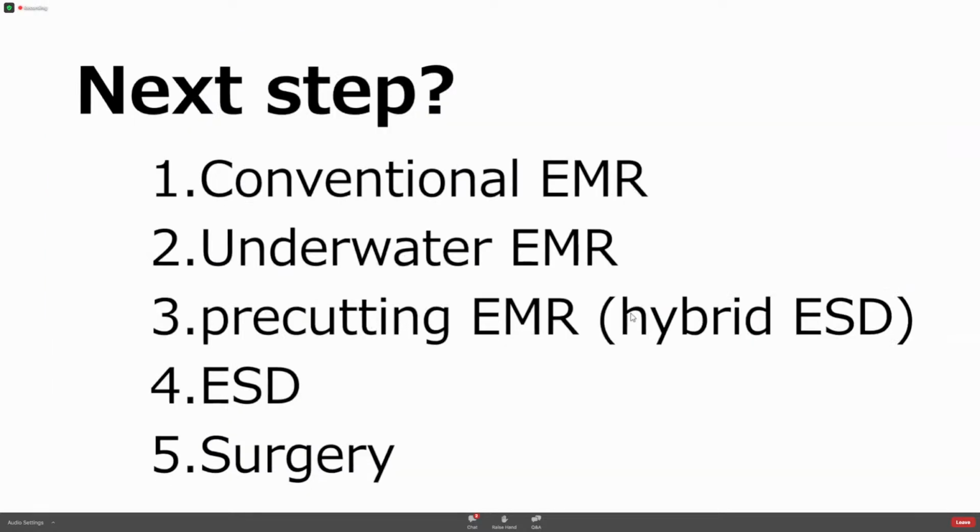So what is the next step? We diagnosed type 3S, not invasive cancer, but we diagnosed mucosal cancer. So what is your next step?